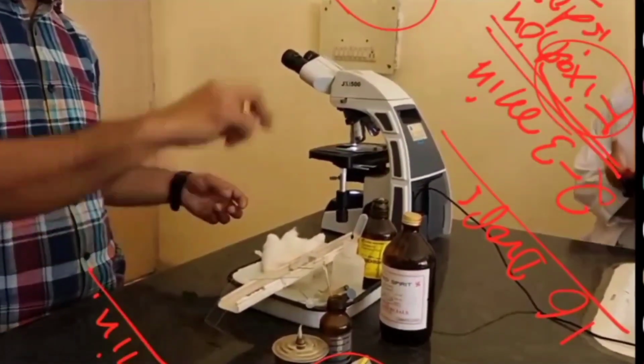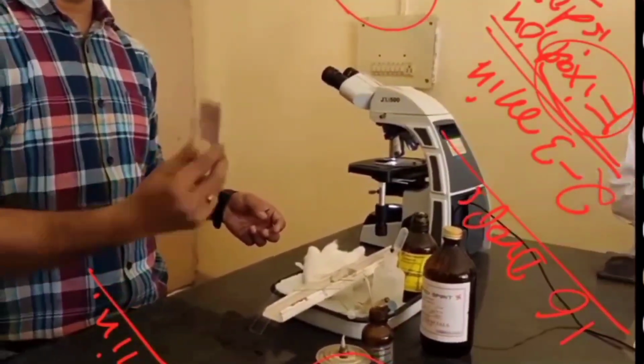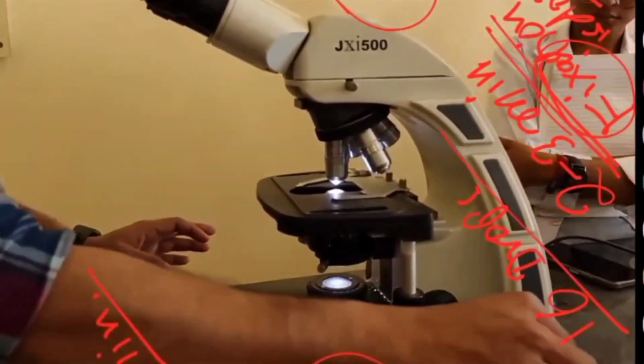So I am drying it by waving it because this is still not completely dry. So we should dry it completely. So now I am going to focus this under the microscope.